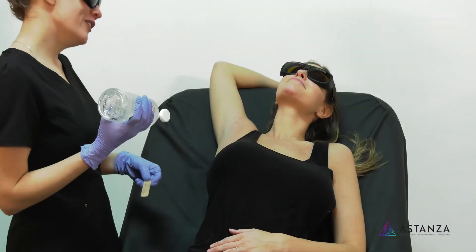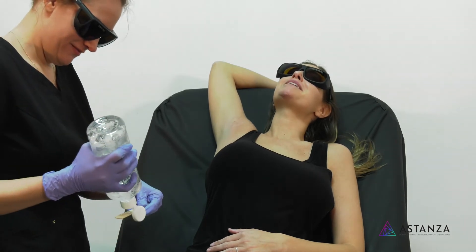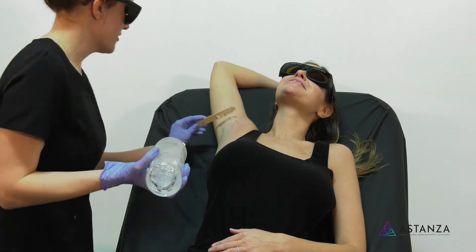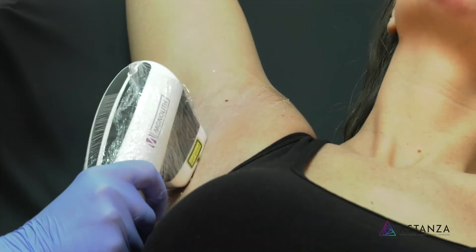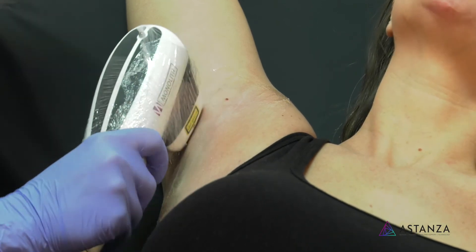Now we're going to do your underarms. Whitley says she's excited — her legs didn't hurt so she's hoping this won't either. Holly confirms it won't and that it'll be a lot faster too. During treatment, Holly asks if Whitley is feeling anything. Whitley says every once in a while she feels a zing but for the most part not much.